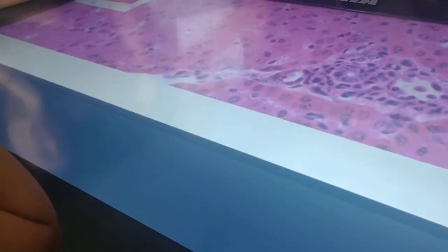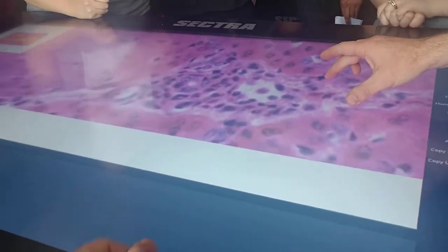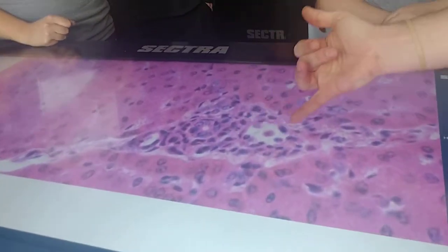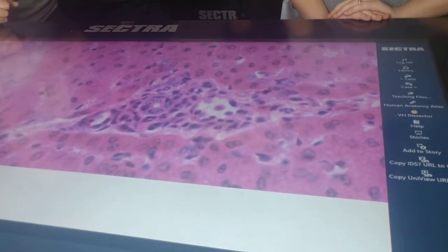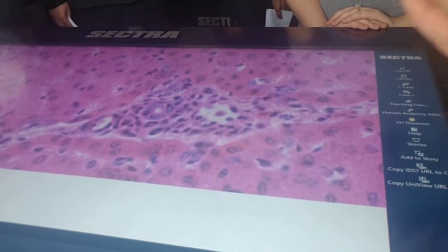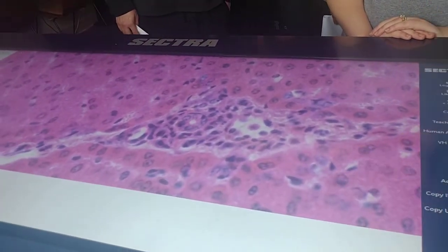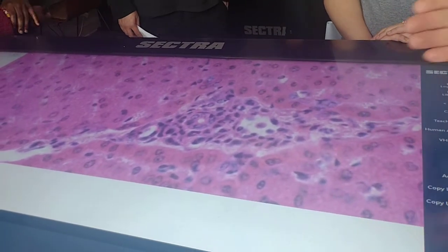This is going to be the artery, so where's the vein? Yeah, this is probably the vein. It looks a little weird to be the vein because normally the veins, especially venules, are probably going to collapse. But the fact that we see something weird in the middle makes me think, maybe not.